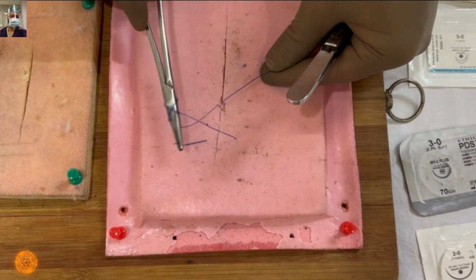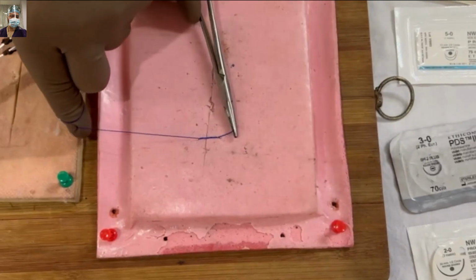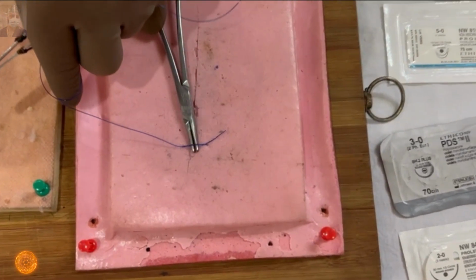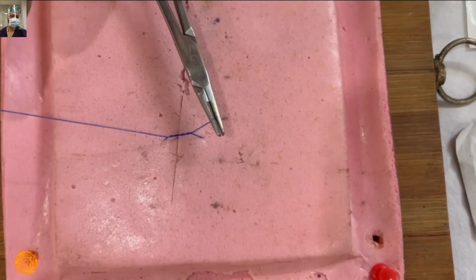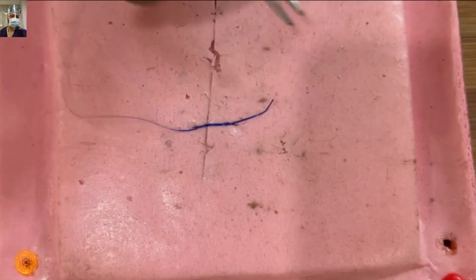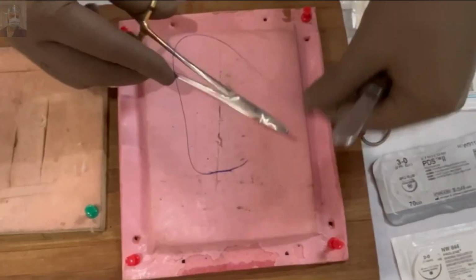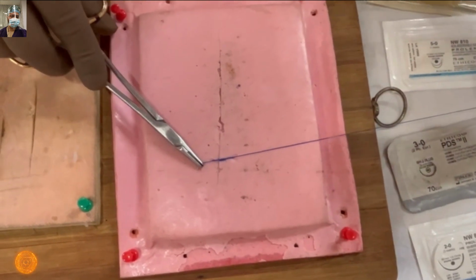So this is a perfect knot tying. I have taken 2 throws, and this smaller end has to rotate every time by 180 degrees. So I have taken another throw, a single throw. The first throw was double, and again the shorter end is going to the opposite side by 180 degrees. Hands have to cross. That gives you better knotting properties. So this is how we will apply the knots.